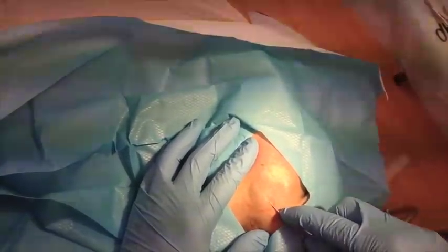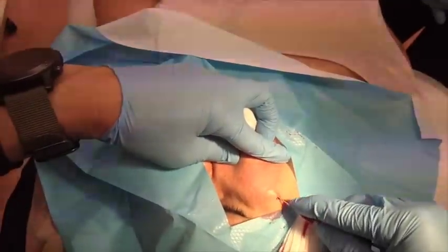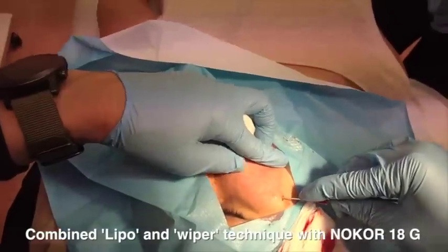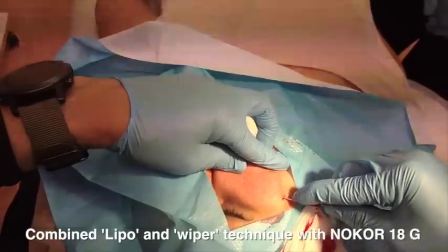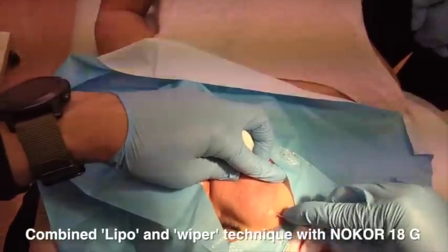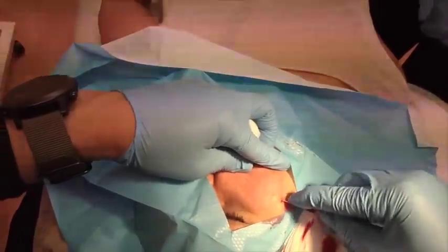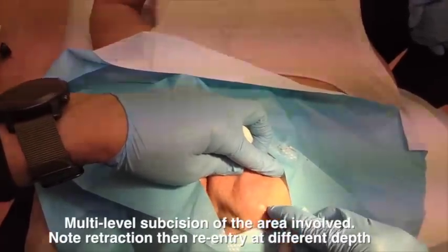I'll show you a few other variations of how I perform no-core to the cheeks. This is a combination of lipo and wiper technique with the 18-gauge no-core, much like what was first described in the original 1995 paper. However, we're now using a blade rather than a hypodermic needle. This is multi-level subcision — going in at different depths.